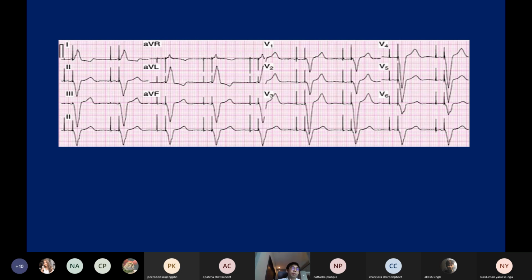If you program the pacemaker with the third code D, it would track the rhythm from the atrium, and if the intrinsic rhythm from the ventricle is not coming, it would pace. But if the intrinsic rhythm is coming, the ventricular lead would inhibit itself, not pace, and let the intrinsic rhythm come out.